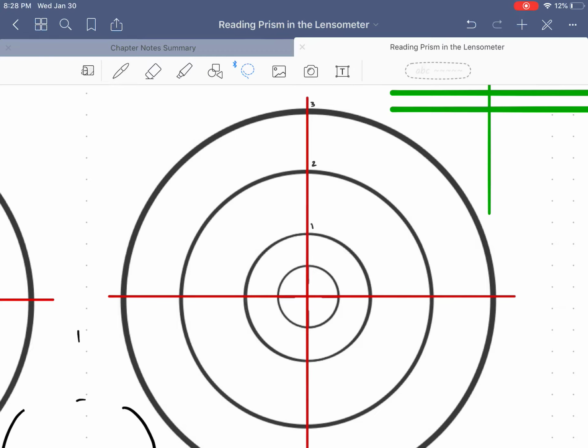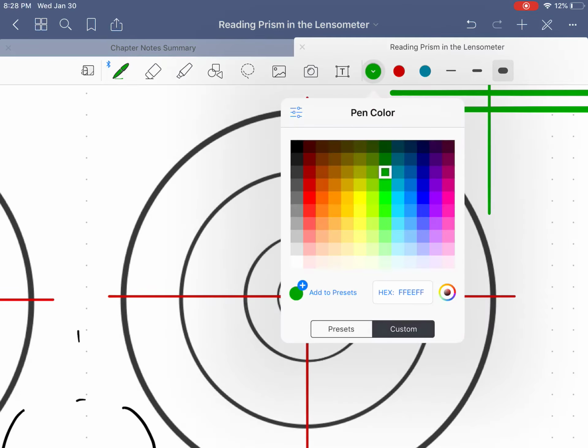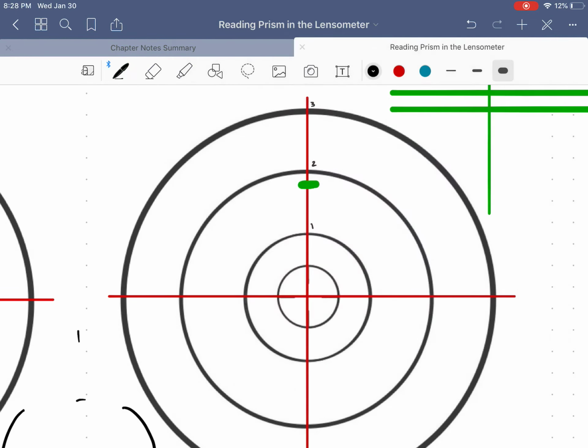It also works out that, let's say we had our power scale right here. You have to kind of figure out what's halfway point. So if our halfway point, we see that here and here is 1 and 2. Halfway is about right there.